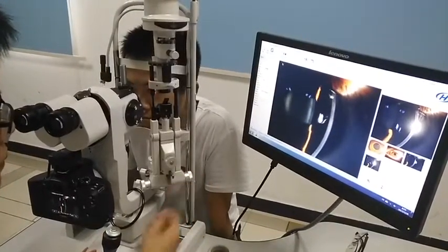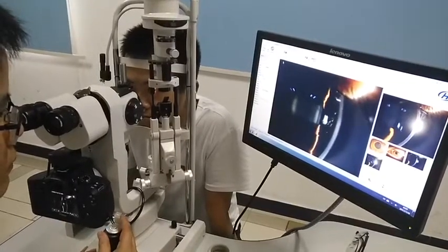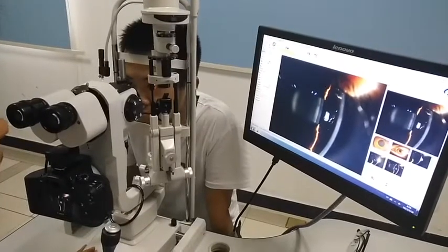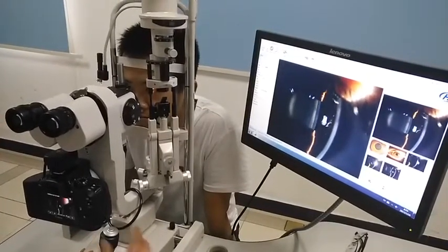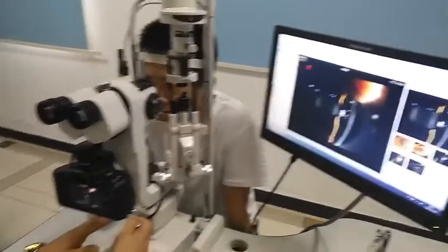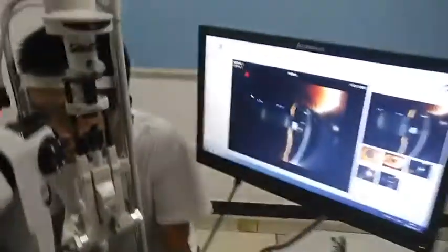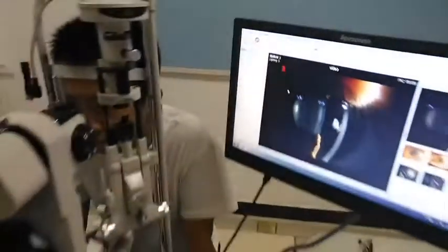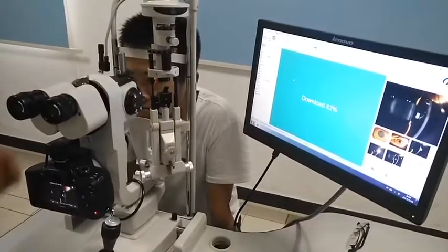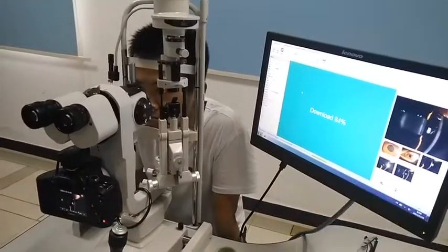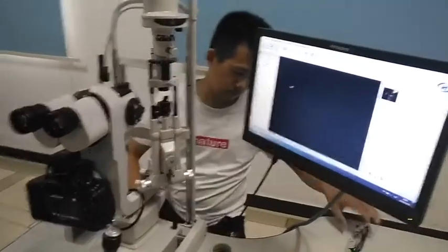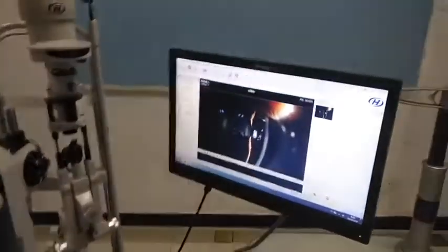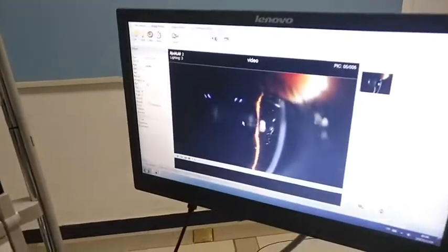This is the lens. If you want to take a video, choose the video mode and press the button. Now you can see the recording starts. Release the button. The video will transfer to the computer. This is the video file — double click it. Now the video will replay back.